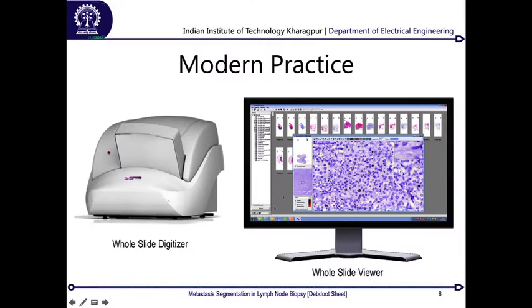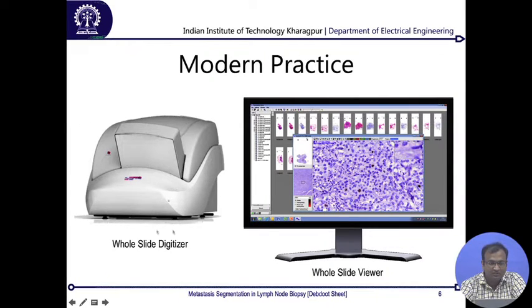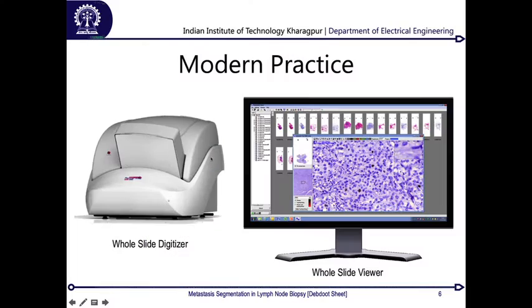Now in the modern practice, for these histologies as well, we have a similar kind of option, which is something called a whole slide imager or a whole slide digitizer. You take that complete slide and mount it onto a cartridge over here. There is basically a robotic microscope inside this box, and it takes an image of one portion and then slides the slide by a few millimeters, or whatever resolution you need, and then takes another. So you have basically a tile of such images created.